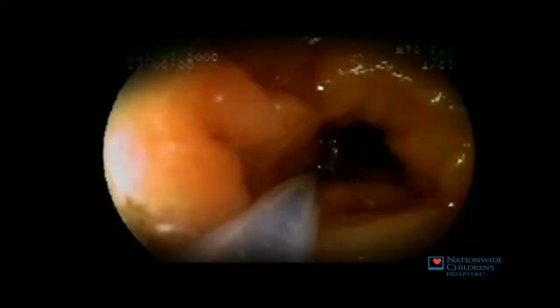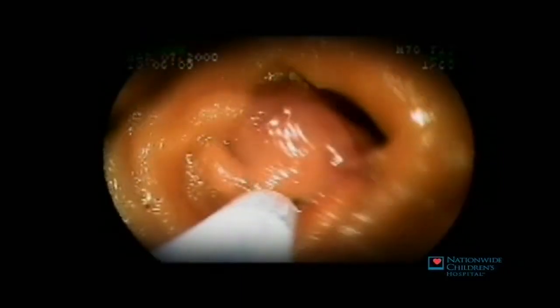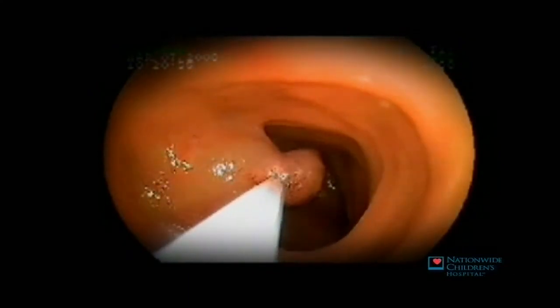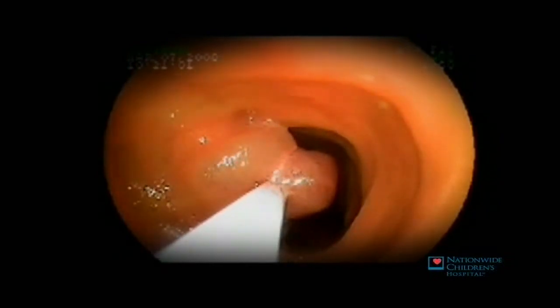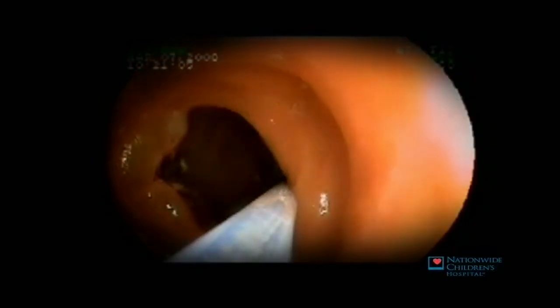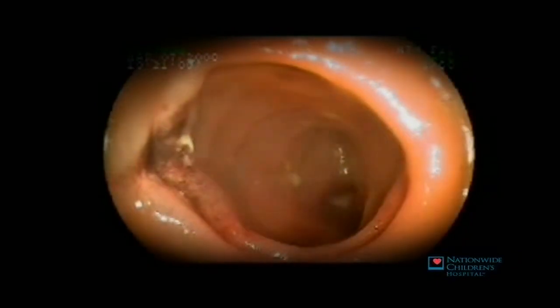Once the polyp is successfully secured, it's gently pulled back and away from the small intestinal wall. Electric current is then passed through the catheter wire. This then generates heat, cauterizing the polyp, preventing bleeding. Higher frequency current is then passed through the wire, which then literally cauterizes or vaporizes the tissue, cutting the polyp from the wall, as seen here.